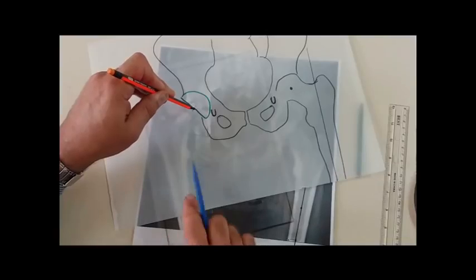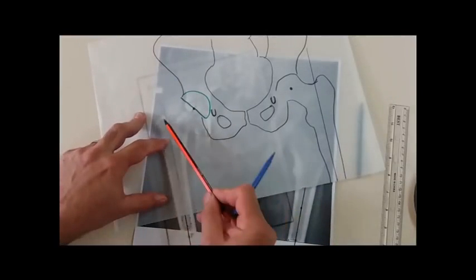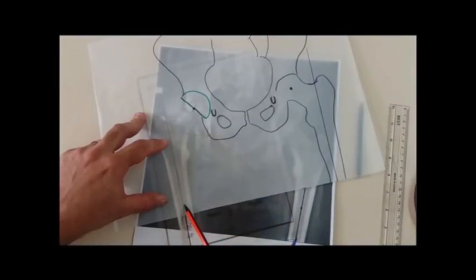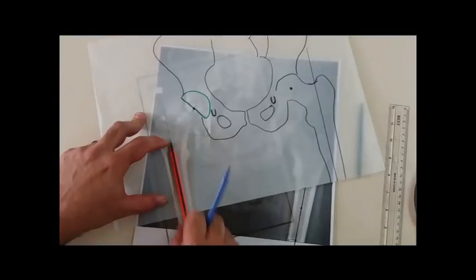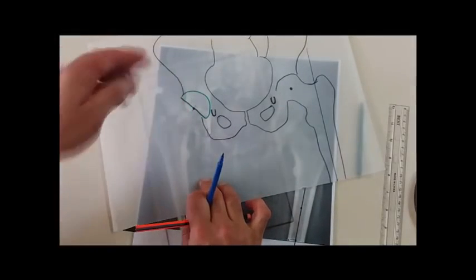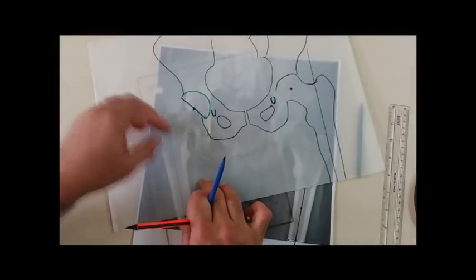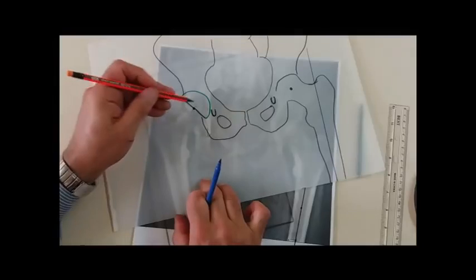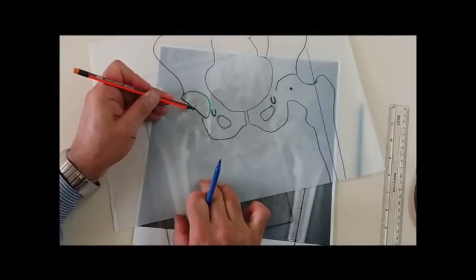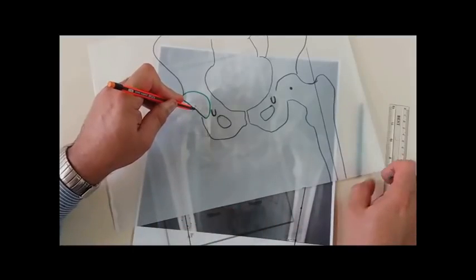of the medullary. For example, in this case, this is the line, the intramedullary line of the femur, which is the same as the longitudinal line of the stem. This is the line. And I should rotate my tracing paper so that the rim of the paper is parallel to that line. Keeping in mind, I should keep the center of rotation with that of the stem. Just repeat the same procedure.